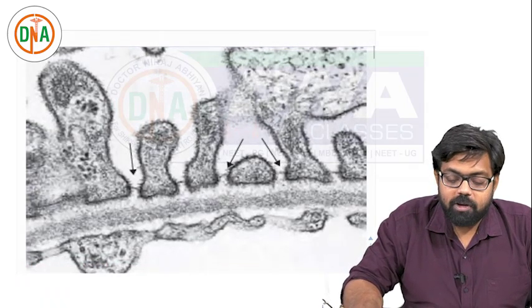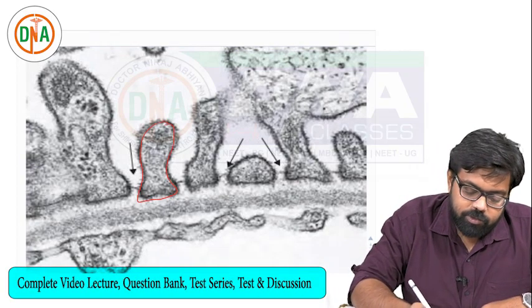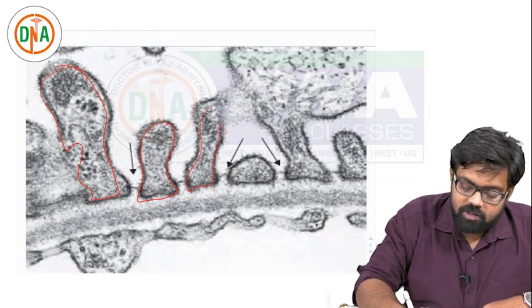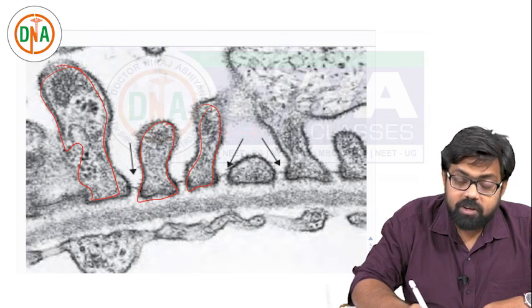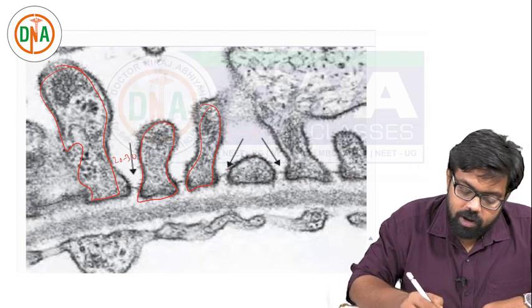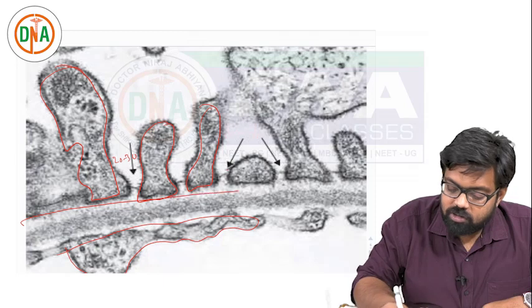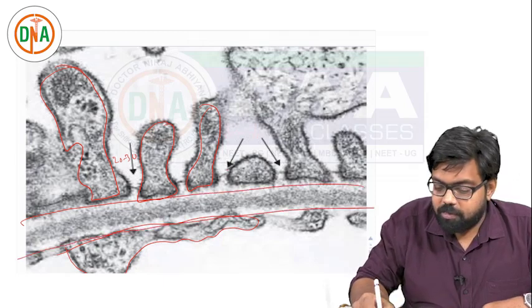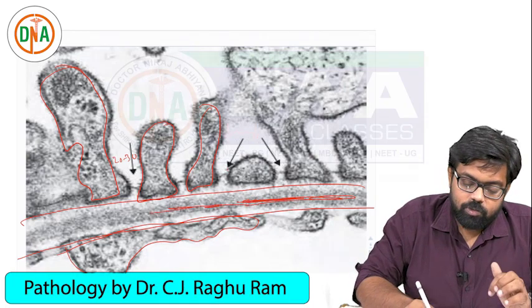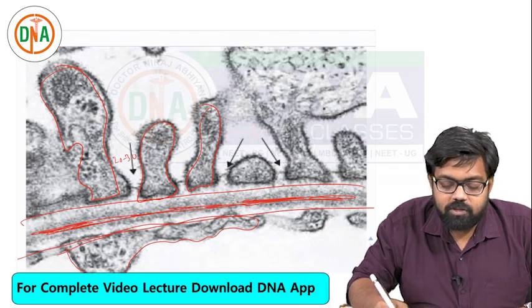This is a real electron microscopic image showing a normal glomerulus. These are the foot processes - these are the visceral epithelial cells. These are the gaps between the visceral epithelial cells, which are around 20 to 30 nanometers. And this is an endothelial cell. This is the basement membrane - the central darker structure is the lamina densa, and the outer ones are the lamina rara interna and externa.